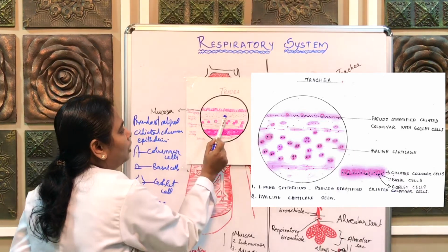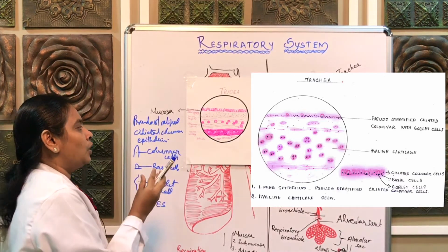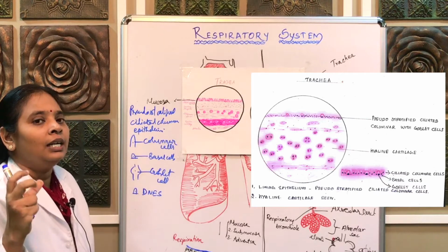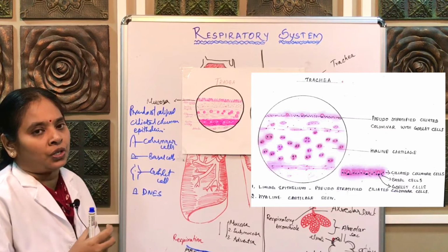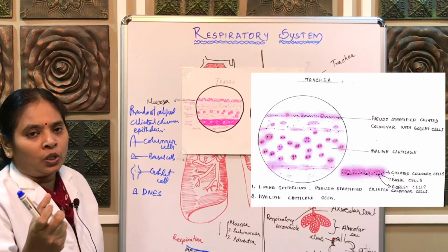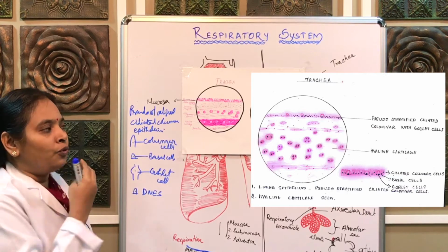Next one is the lamina propria. This lamina propria is infiltrated by leukocytes, lymphocytes and monocytes and basophils, and also has collections of lymphatic follicles. So even from the nasal cavity, in the nasopharynx you will have collections of these lymphatic follicles as subepithelial projections. In the nasopharynx these subepithelial projections are called tonsils, tubal tonsil or nasopharyngeal tonsil. The tonsil is nothing but the collections of lymphatic follicles. Everything is for the purpose of immune function.